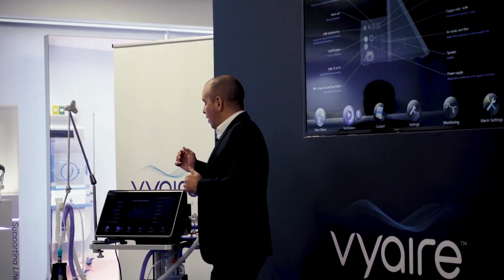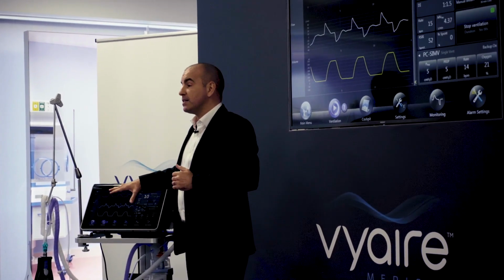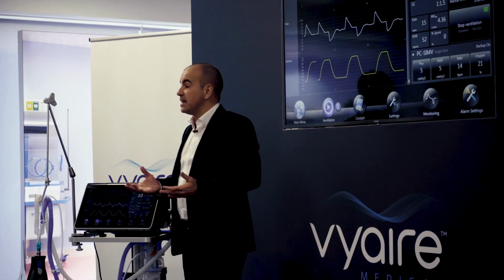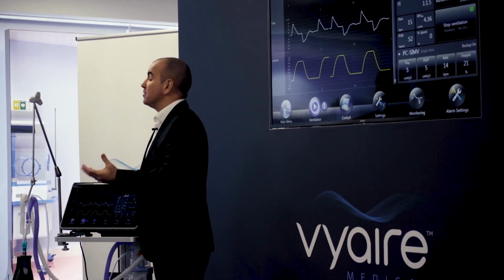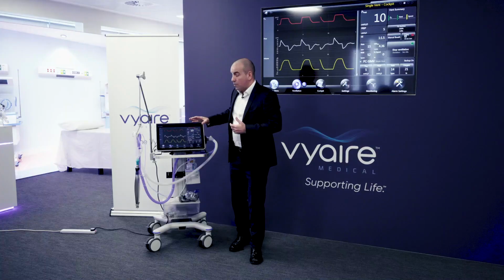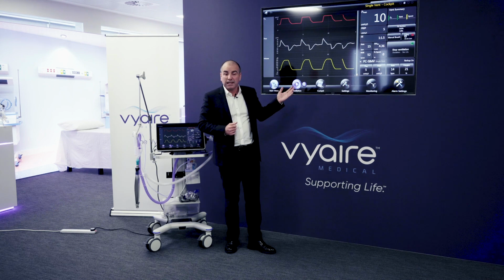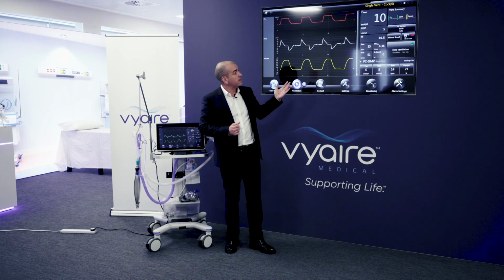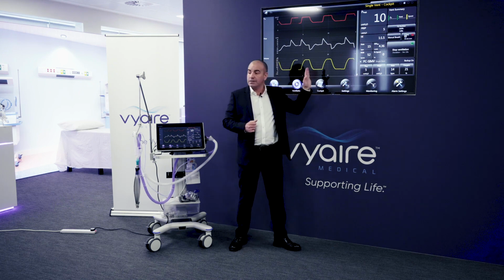In terms of the device itself, you can tailor this and configure it to whatever your clinical need is, or down to granular clinician-specific preferences. On here, we have the generic pressure flow volume waveform that they would typically expect to see on a critical care ventilator. And over on the right, we have some monitored parameters. Again, all this can be tailored.